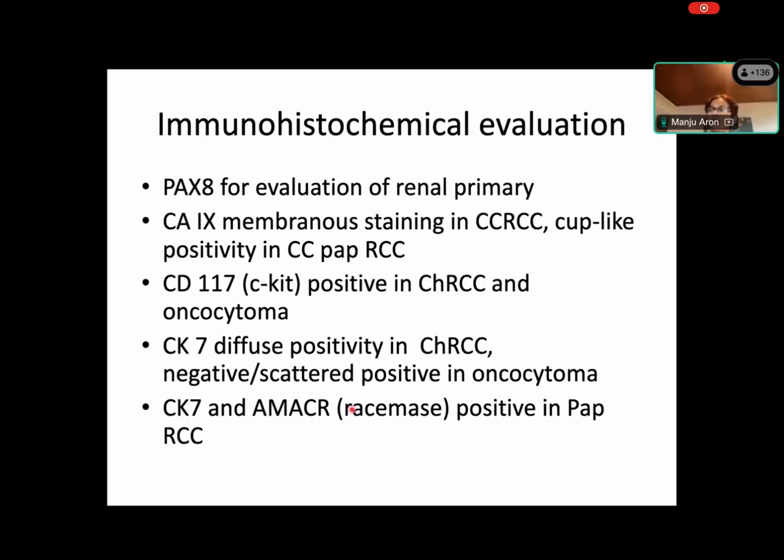Now, when you're evaluating for primary origin, use PAX8. Don't use RCC markers, CD10. These are not specific markers. PAX8 is the best stain to be used. CA9 membranous staining, as I mentioned to you, is what you see with clear cell RCC. Cup-like positivity is seen in clear cell papillary. This should be tumor, sorry for that mistake here.